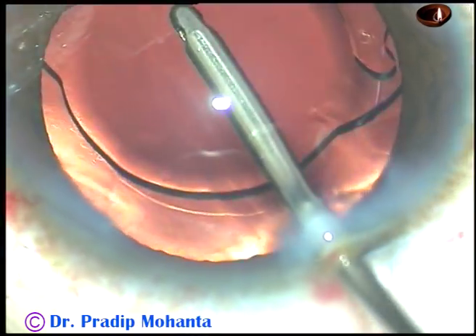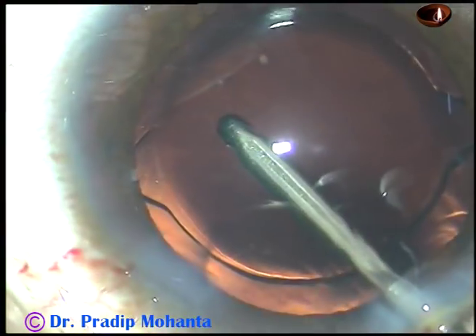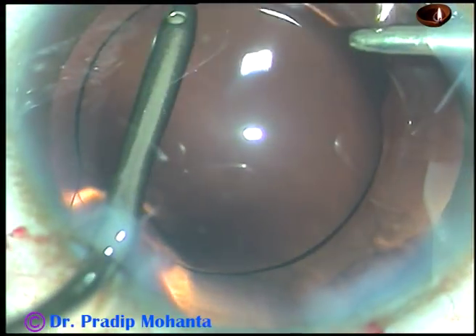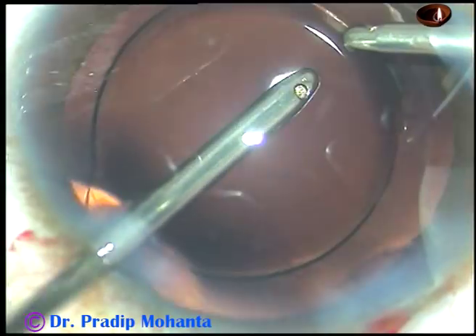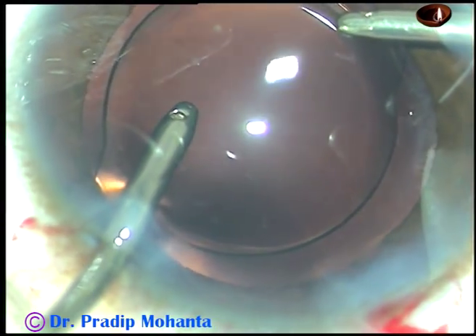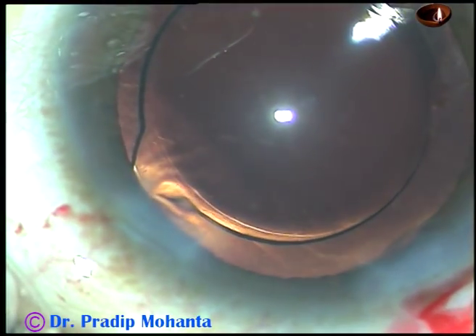The capsular bag has been irrigated. This is irrigation of the anterior chamber. This is stage three of visco removal: irrigation and aspiration together. If you remove the visco thoroughly like this, you will never see post-op rise of intraocular pressure.